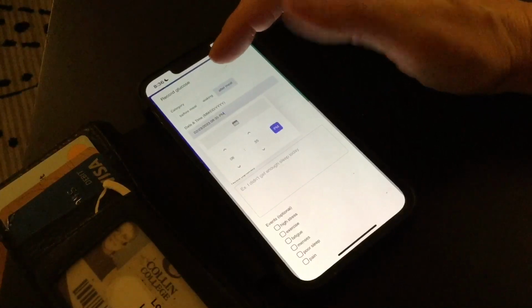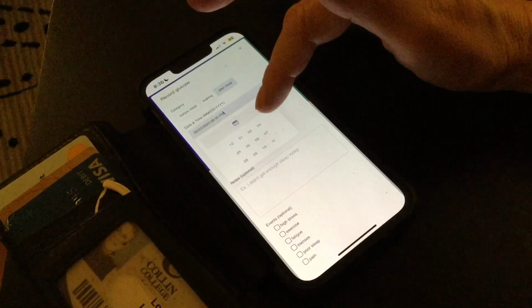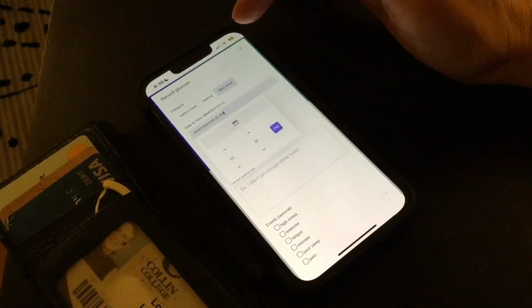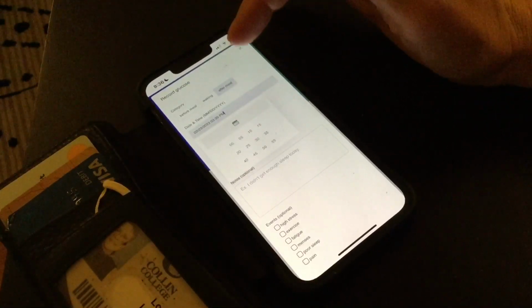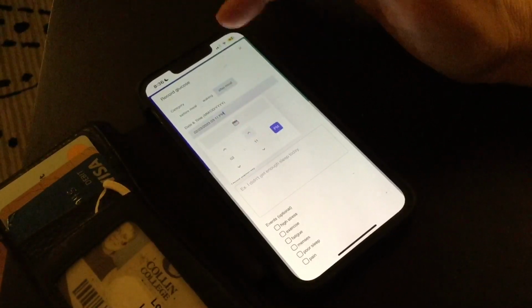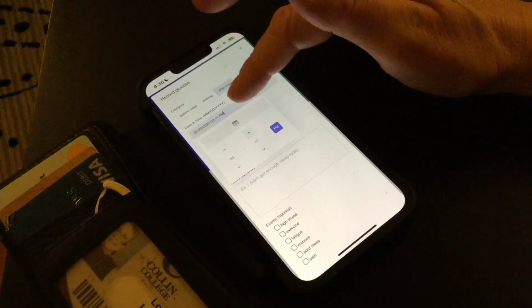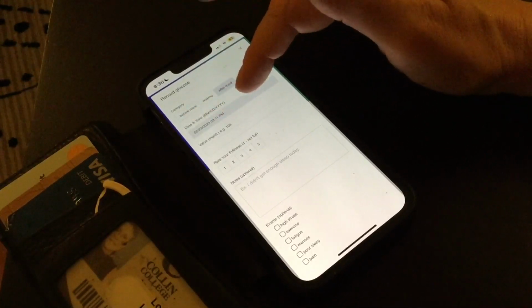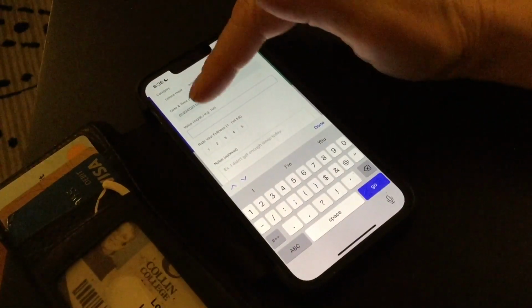3:11 p.m. today. So I can touch the hour and adjust the hour easily by hitting the 3 o'clock. It's already on PM, so then I'm going to touch the minutes, and I can hit 10 and just arrow up 1, and now I have 3:11 p.m. So it's all set. I will go back and touch the gray bar, and the date and the time are correct. And I'm going to put in my glucose value, that was not a pretty value.